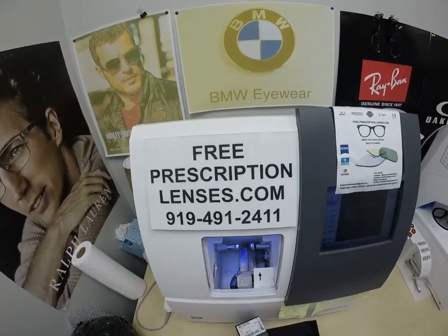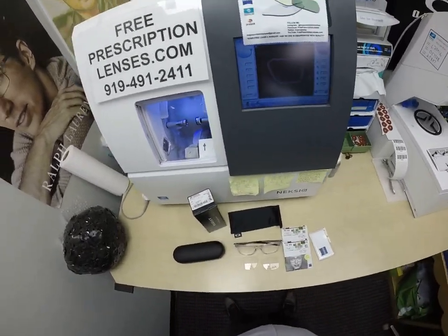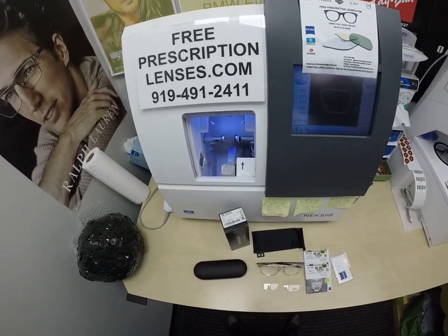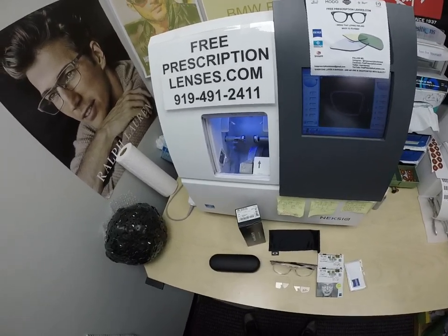This is freeprescriptionlenses.com, where everyone loves a bargain and no one is disappointed with quality. I'm the hardest working optician in the industry. My name is Seymour Better — but call me Moe, Moe Better — because I'm going to have you see a Moe Better look and show everyone else how I bring that loving feeling back to glasses when I show you Van's Oakley Wheelhouse.